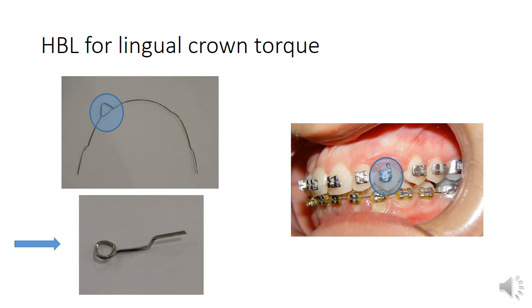The bend in the activation stick here has two functions. First, it acts as a stop to prevent the stick going further inside the vertical slot, and second, makes a space for the horizontal box loop to be kept under it. We can see in the next slide.